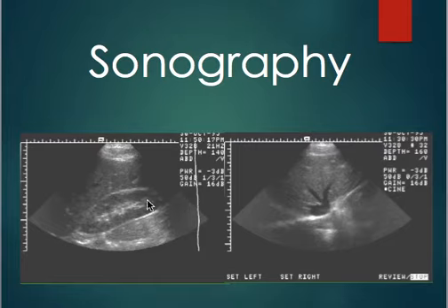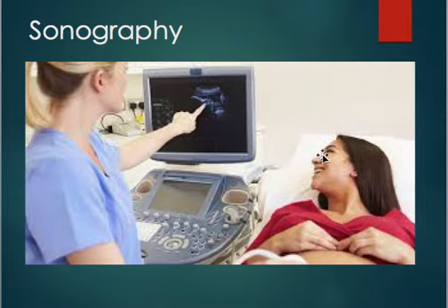This is an image of what an ultrasound suite or room would look like. So you've got a bed where the patient can lay down, the machine here, and the screen, and then obviously you have the sonography technologist who's explaining what she sees on the image to the patient, which is very common.